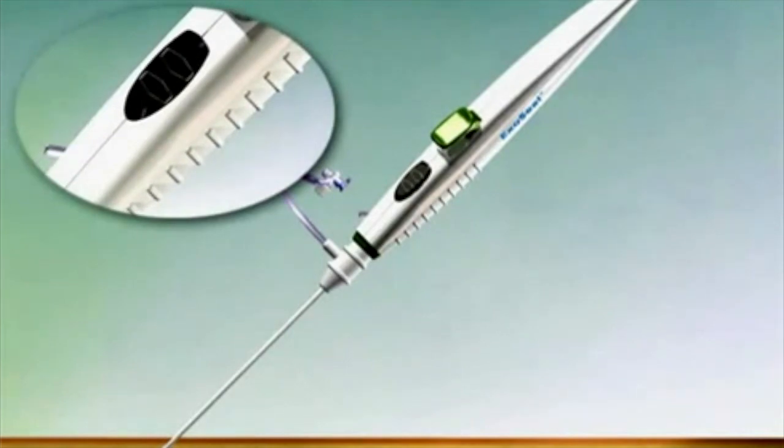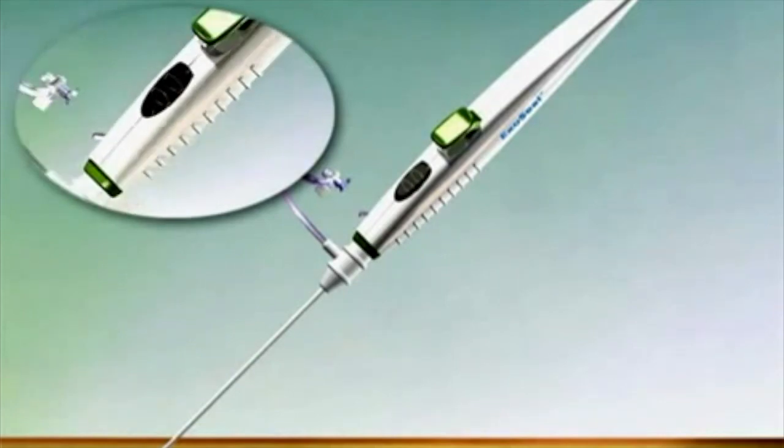Once the graphics pattern in the indicator window has changed to solid black, the device is in optimal position for extravascular plug deployment.